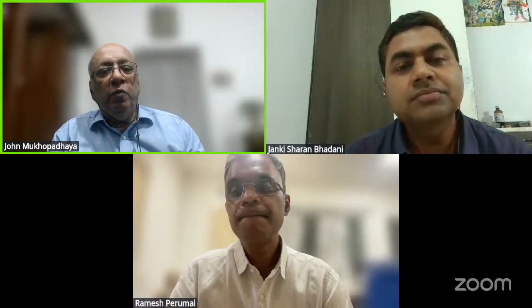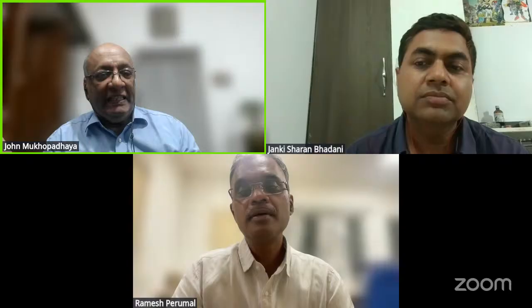Yeah, I think what happens is that although the CT will tell you everything, because you can actually get the obturator and iliac views on the CT scan 3D reconstructions as well. Yes, sir. But in the OT, most people only have the X-rays and not the CT scans.